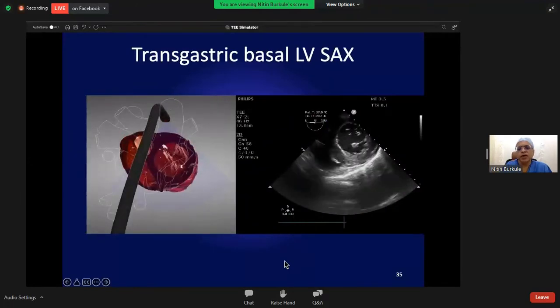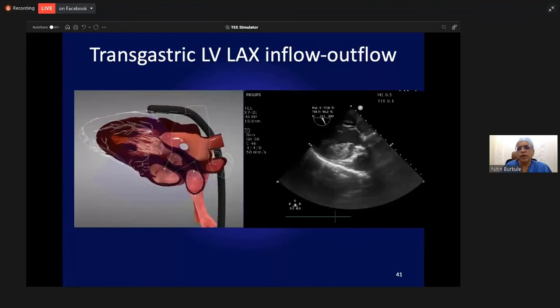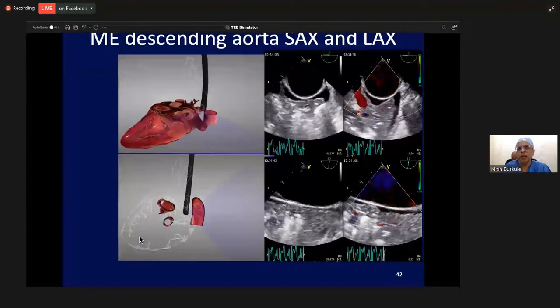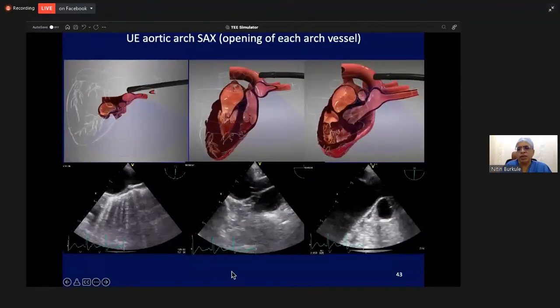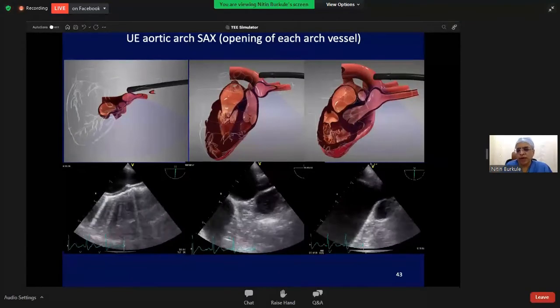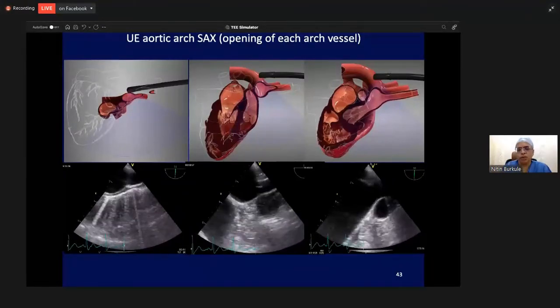Then you have got a transgastric window to look at the short axis of the heart and also to look at the LV long axis inflow and outflow. And then you get marvelous views of the descending thoracic aorta and the arch of aorta. These are extraordinary views which can show you a lot of plaques and mobile thrombi in the arch of aorta and can find out the cause of a lot of cryptogenic strokes.